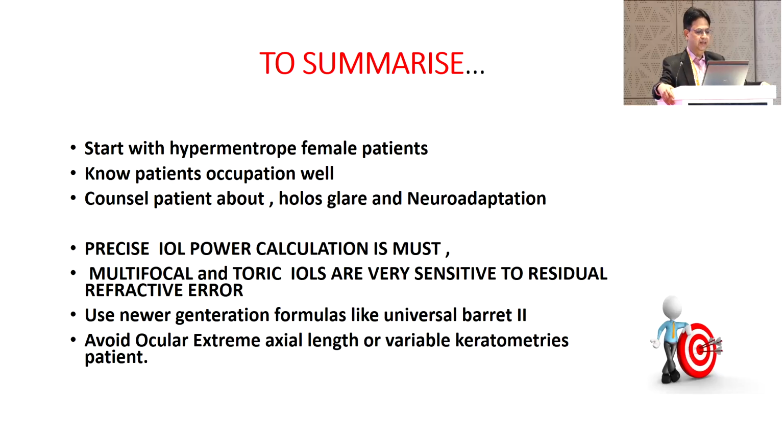To summarize, start with hypermetropic female patients, know the patient's occupation very well, and counsel the patient about halos and glare, especially with the multifocal lenses. Precise IOL power calculation is needed. The multifocal and toric lenses are very sensitive to residual refractive error. Use newer generation formulas like the Universal Barrett II formula. Avoid extreme axial lengths or unusual keratometries.